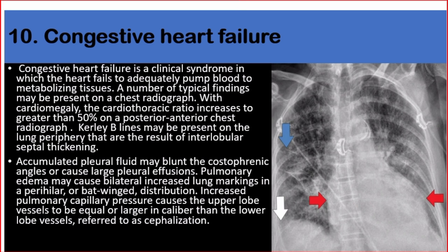Number ten: congestive heart failure. Congestive heart failure is a clinical syndrome in which the heart fails to adequately pump blood to metabolizing tissues. A number of typical findings may be present on chest radiograph. With cardiomegaly, the cardiothoracic ratio increases to greater than 50% on a posteroanterior chest radiograph. Kerley B lines may be present on the lung periphery, resulting from interlobular septal thickening. Accumulated pleural fluid may blunt the costophrenic angles or cause large pleural effusions. Pulmonary edema may cause bilateral increased lung markings in a perihilar or bat-wing distribution. Increased pulmonary capillary pressure causes upper lobe vessels to be equal or larger in caliber than lower lobe vessels — referred to as cephalization.